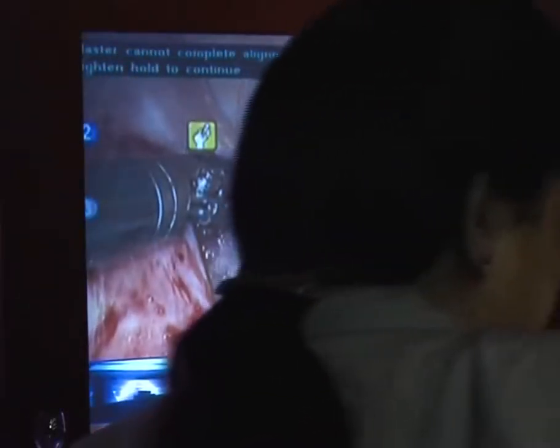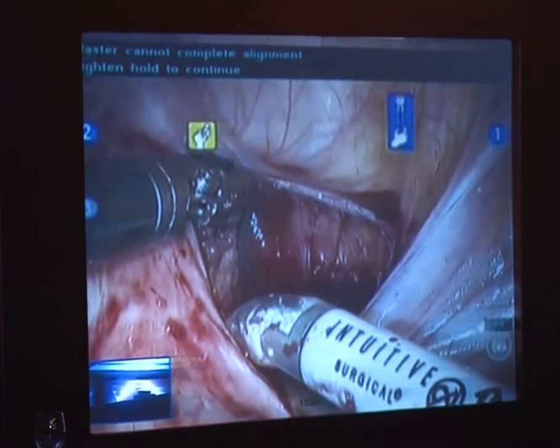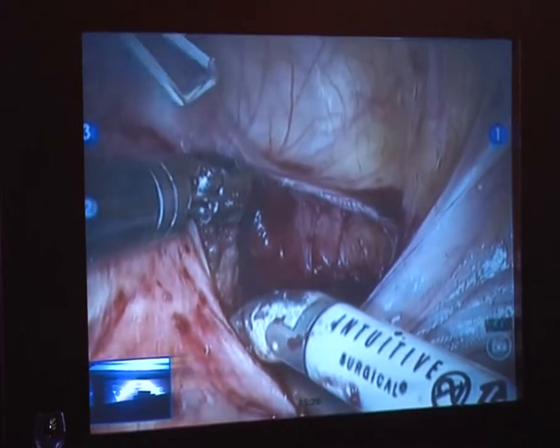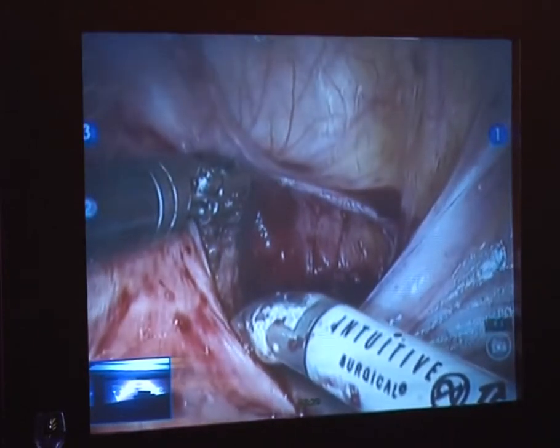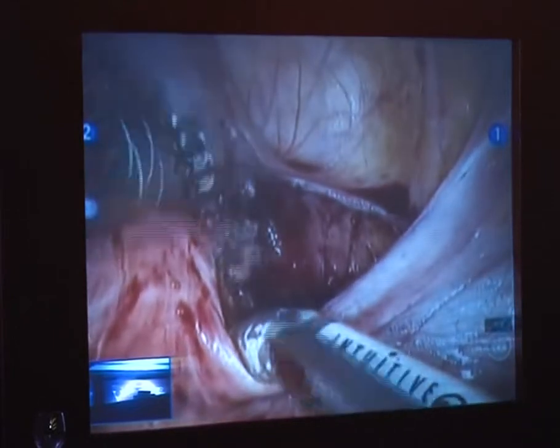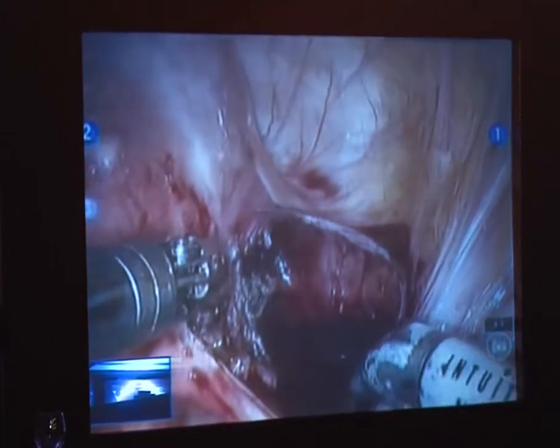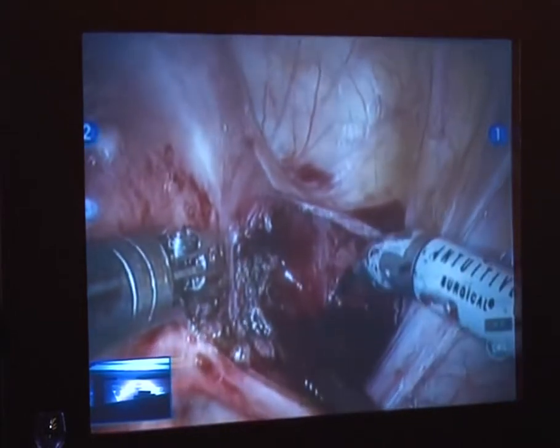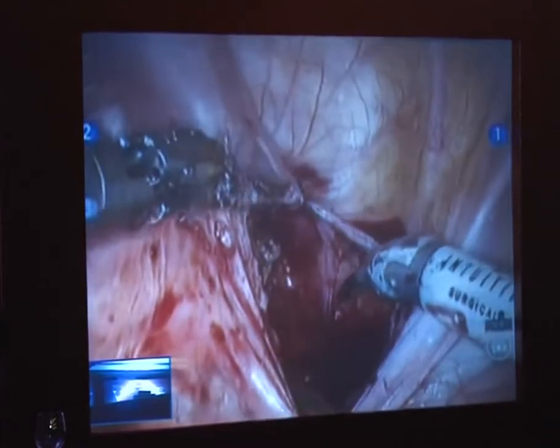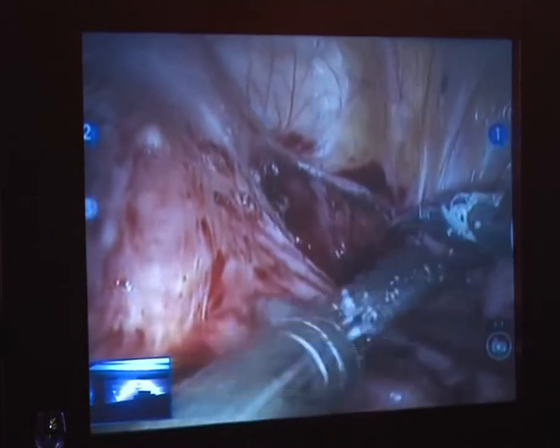But I do like your point. If you're concerned, if you do have some bleeding, and I have done this before, it sounds like you have too, David, a good place that you can put Floseal or Tisseel, Surgicel, anything if you're concerned that you might have a little bit of ooze afterwards. There's nothing wrong with that. But I think that what we can do is do a low pressure check. Can we drop the pressure to less than 8? Let's see if there's any ooze in here. Suction the fluid out to less than 8, please.